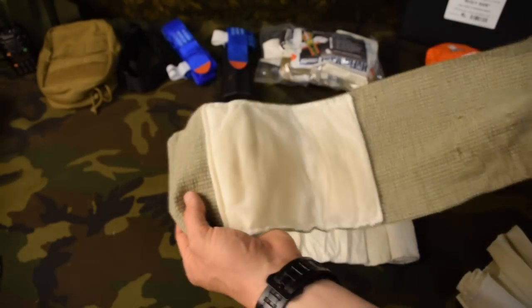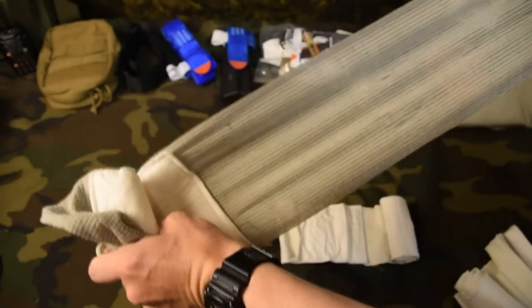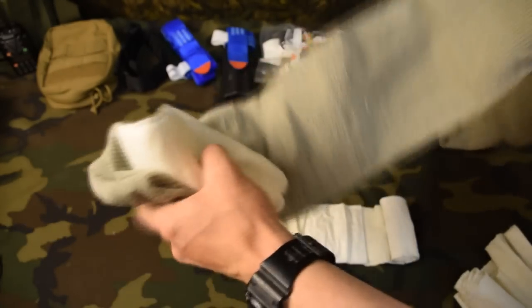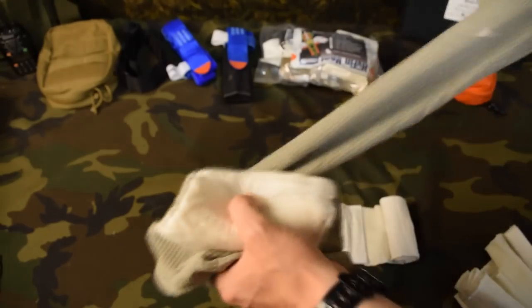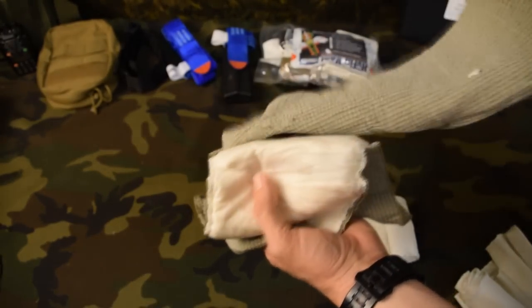As we roll out the Israeli bandage, it's kind of the same style material — just got that stretch to it. There again, you're pulling, generating pressure, then wrapping and securing it.